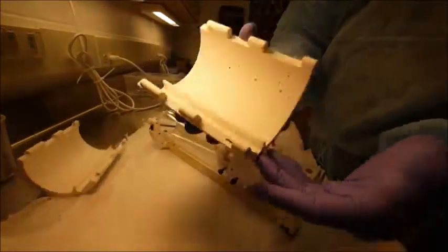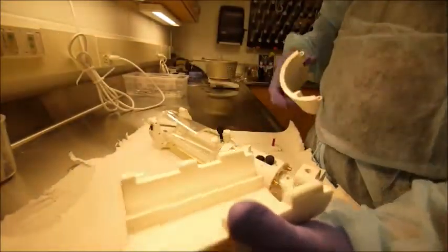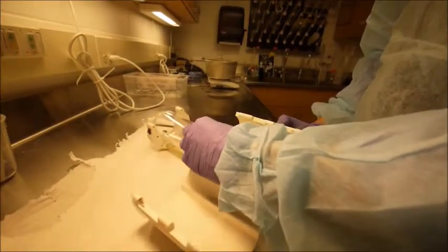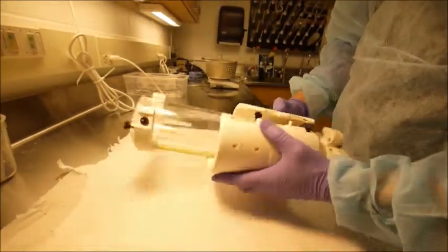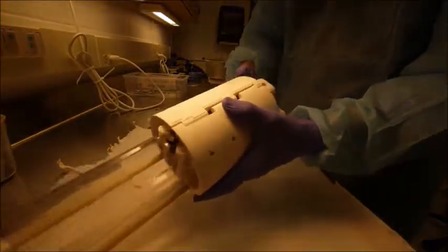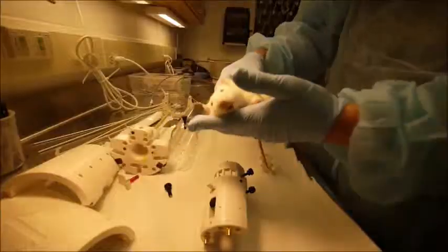The RF shield comes in two pieces. Each piece comes with a sleeve that fits onto the rails of the chassis. When positioned on the chassis, the two pieces slide together and move along the chassis. It is important to remember that the coil is tuned and matched during manufacturing with the shield in place, so always remember to include the shield when tuning and matching the coil in the magnet.